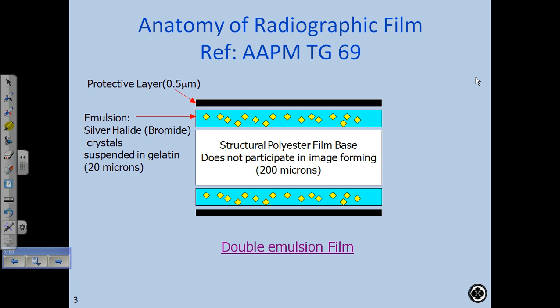So first of all, the anatomy of radiographic film. You folks have seen radiographic film. That's the film we use in radiation therapy or in diagnostic radiology, and that's the older film. It has to be light tight because it's sensitive to ambient light. So it's either in a cassette, and I have a cassette in my office I can grab during the break, or it's in what we call a ReadyPack envelope. They're envelopes that are completely opaque and don't let light come in. It's exposed with radiation to give us an image.